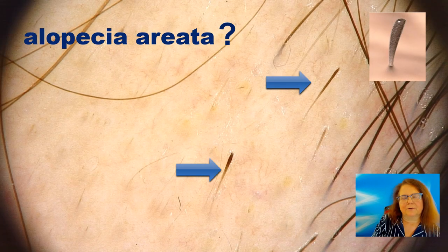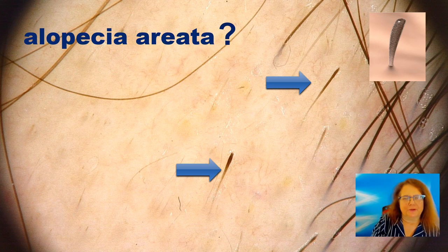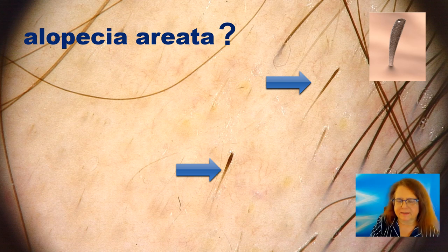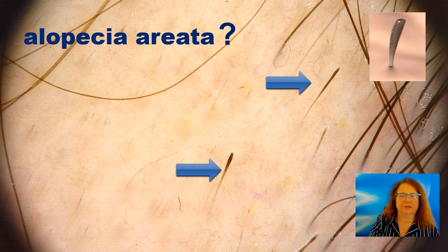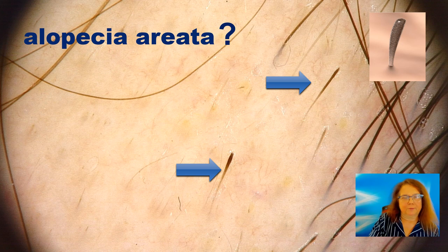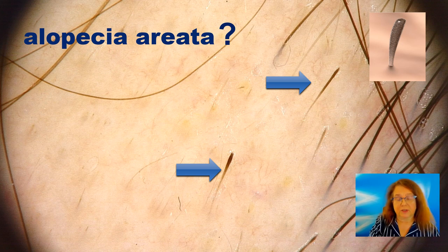This is how typical exclamation mark hairs look in trichoscopy. However, we can never be sure that exclamation mark hairs mean alopecia areata, because there are some other diseases in which exclamation mark hairs may be present — trichotillomania, toxic alopecia, drug-induced alopecia, chemotherapy-induced alopecia, and many more. So we have to look for other trichoscopy features of alopecia areata.